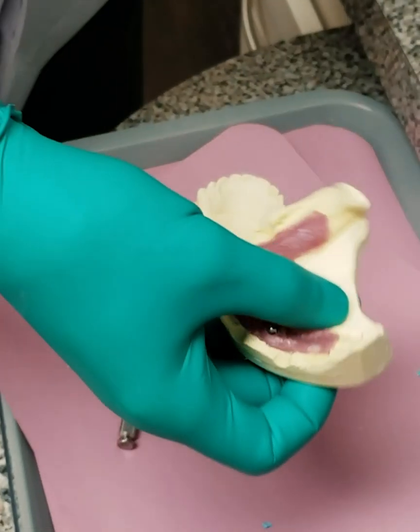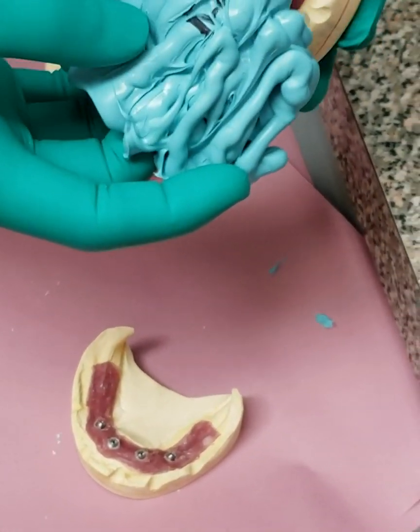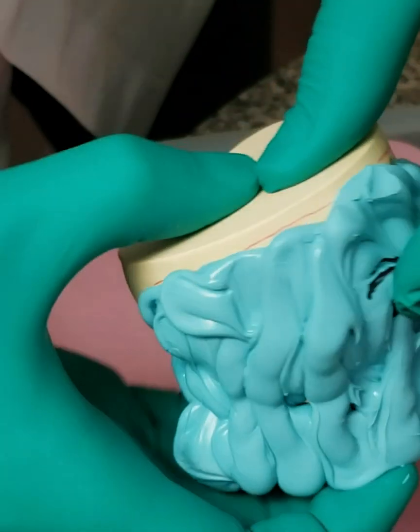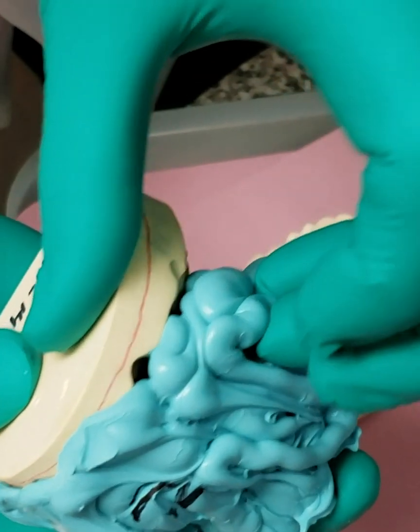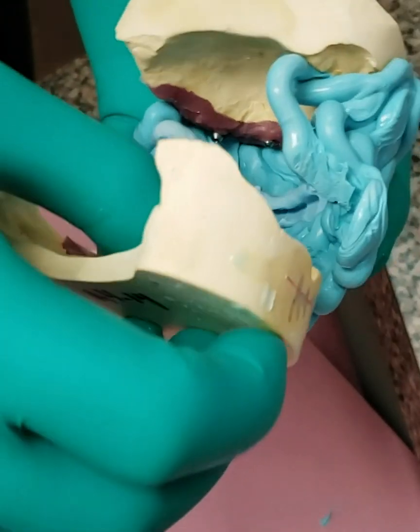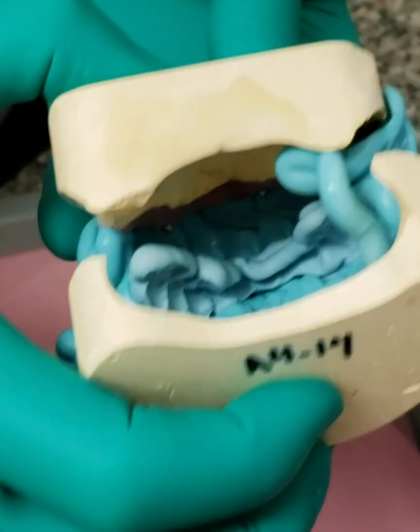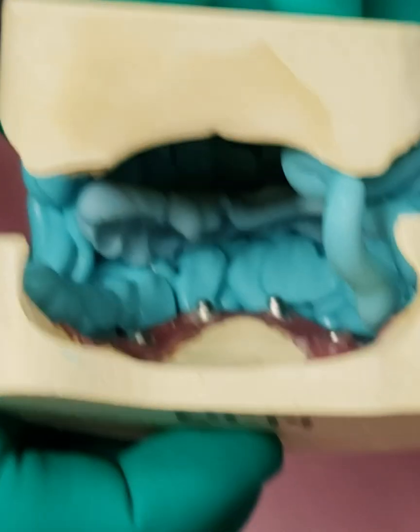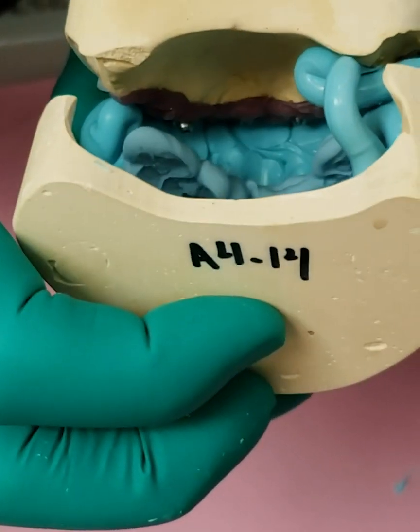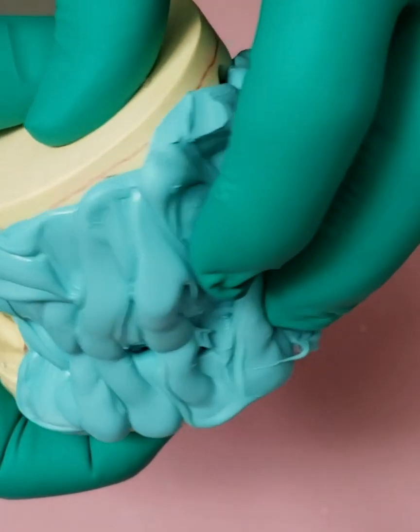Now, to double check a double, what you'll do is take bite number 2, and the upper should lock into it exactly. Ideally, it should have come up in there a little bit more, but it's still very stable. Then you put the lower, and the laboratory now has the upper mounted and the lower mounted, so you wind up mounting the upper to the lower, and you have the exact relationship of the upper to the lower, and the bites are locked in.